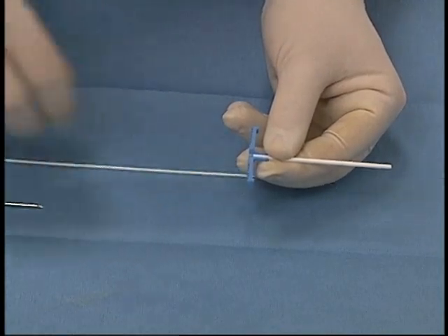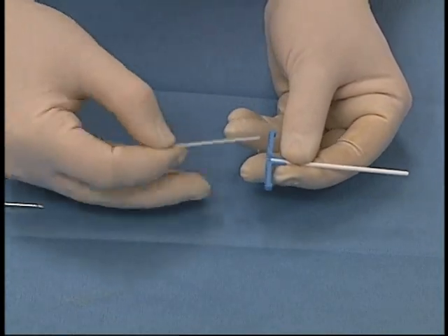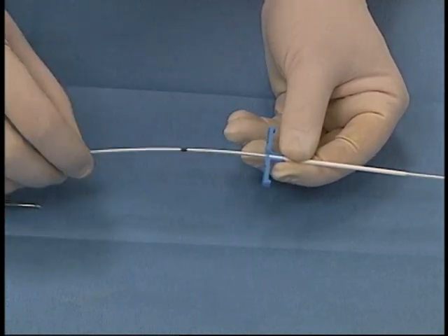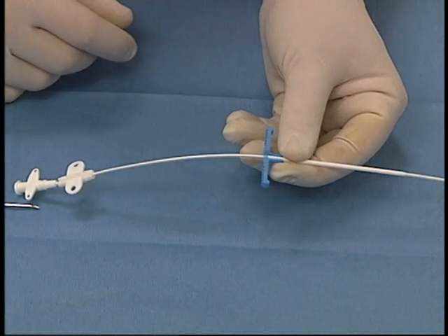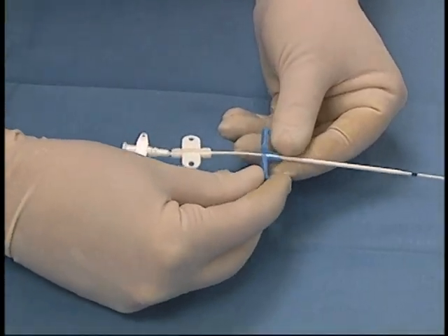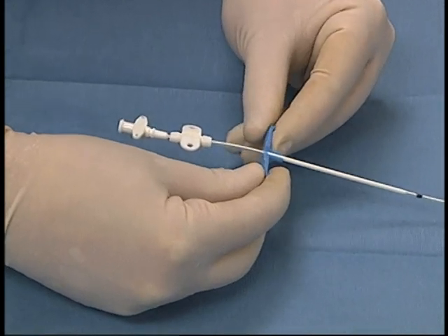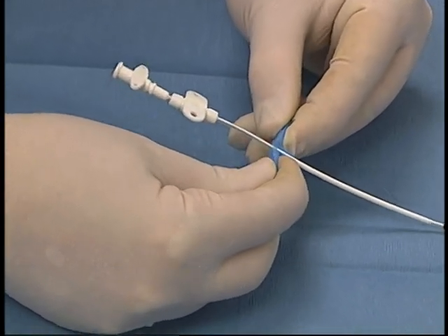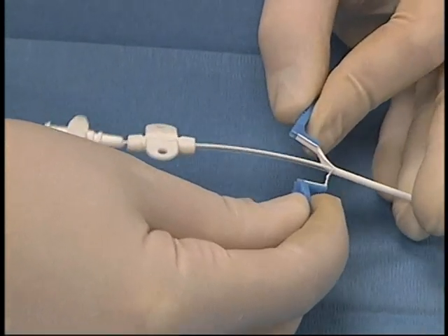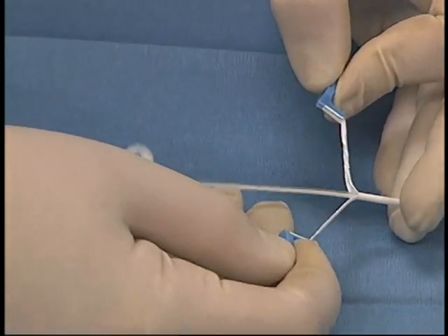A peel away sheath with a stylet is inserted into the vessel. The stylet is removed and the catheter is inserted through the peel away sheath. The catheter will be inserted to a pre-measured level. Once it has reached that level, the peel away sheath is snapped and gently peeled off the catheter, while the catheter is inserted more completely into the vessel.